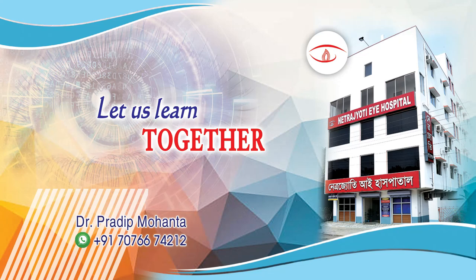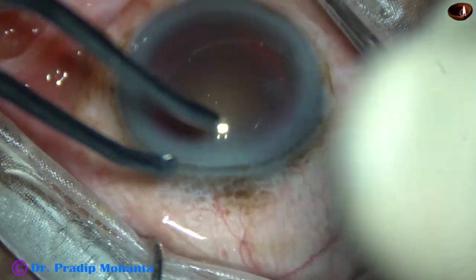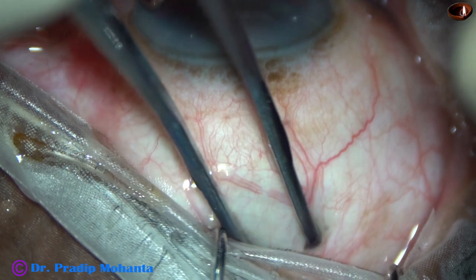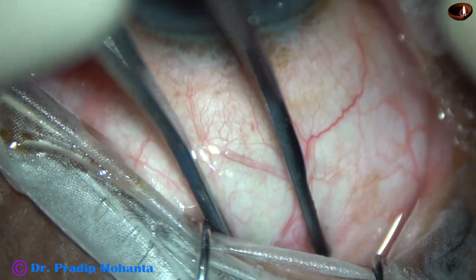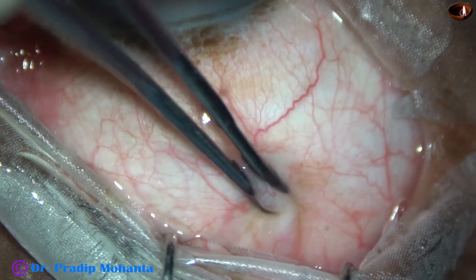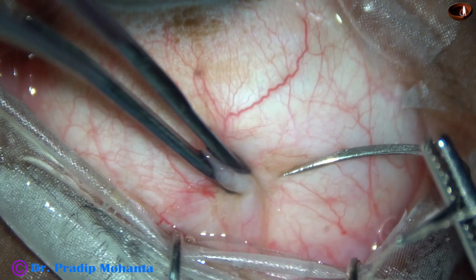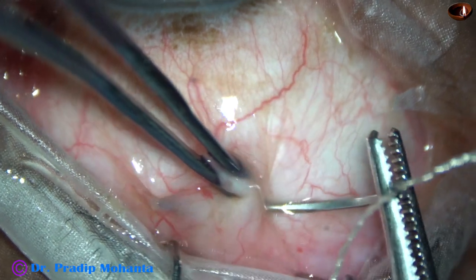Friends, welcome to my workplace at Ranaghat, West Bengal, India. This is a very hard cataract and in this case I am going to do ECCE, that is Extracapsular Cataract Extraction, and I am going to apply only two sutures. Let us observe this surgery.